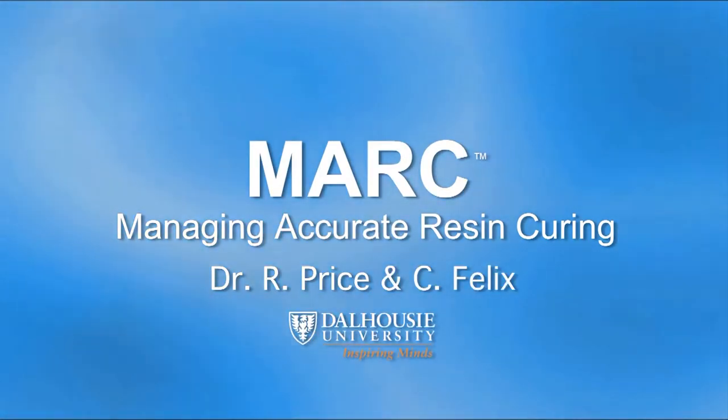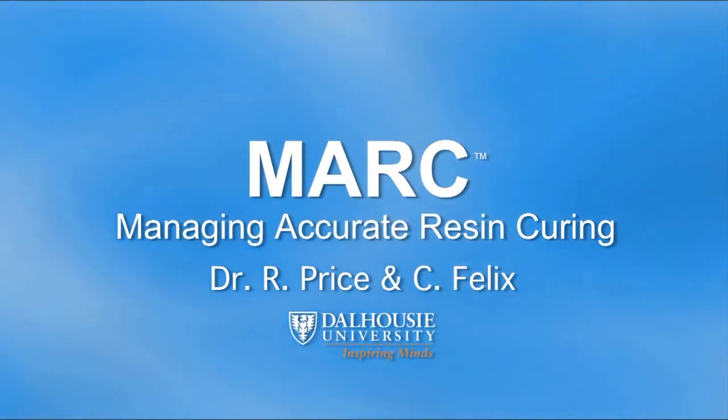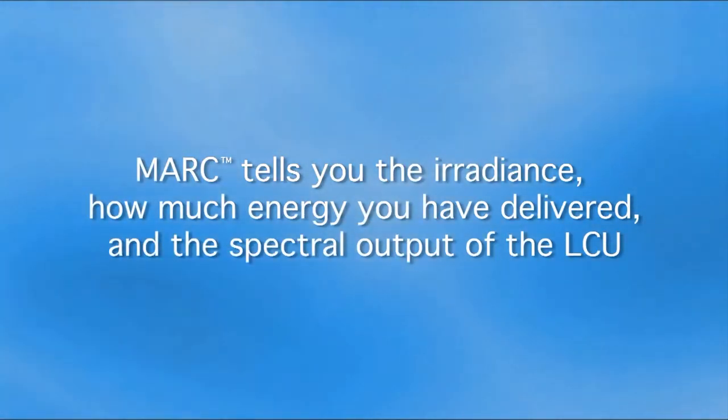This video will show how researchers can use MARC to accurately record the irradiance, the total energy, and the wavelengths received by their resin specimens.